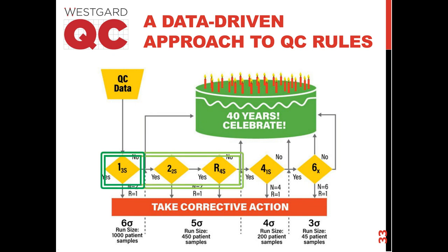If your method is 5 sigma, well, remember that's excellent, but we're going to expand the recommendation to 3 Westgard rules. Now you add the 2-2S, now you add the R4S. You're still just making 2 measurements, it's all done in one run. At 4 sigma, now we need 4 Westgard rules. We have good performance, but we need more control, more rules to properly monitor the method.